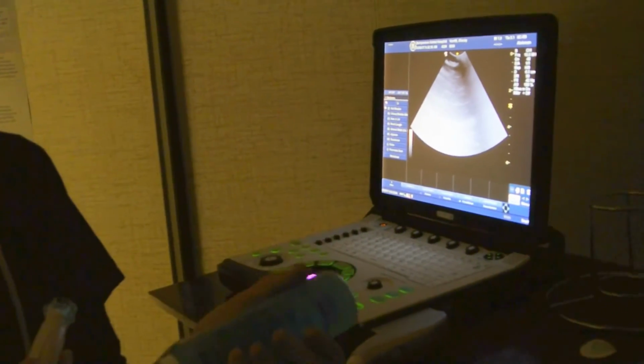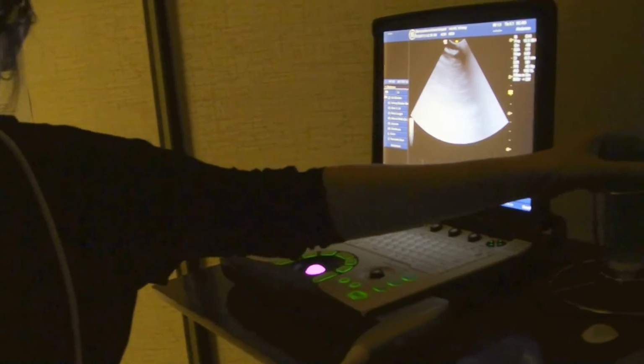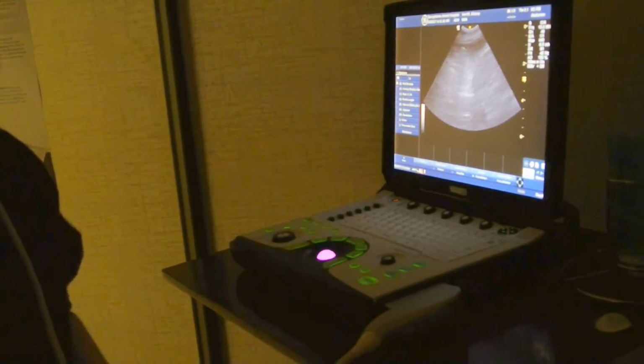She's going to be better probably than most of my sedated patients, thanks to Mom poking and prodding her. Yeah, Gracey's a very cooperative patient.